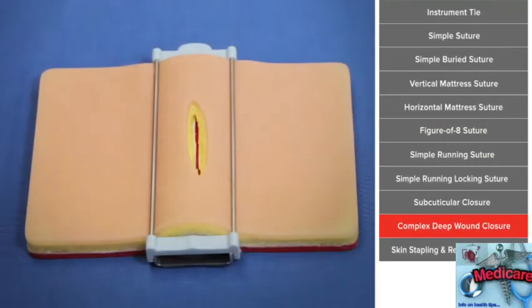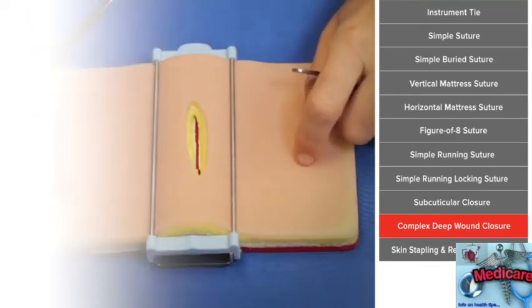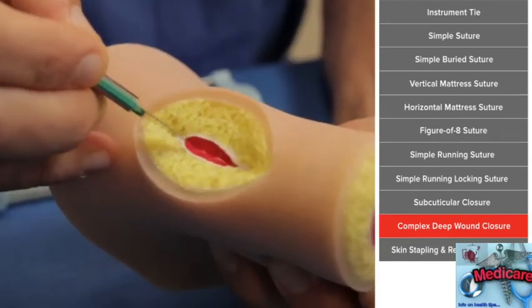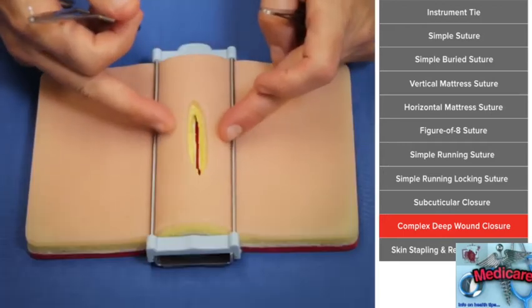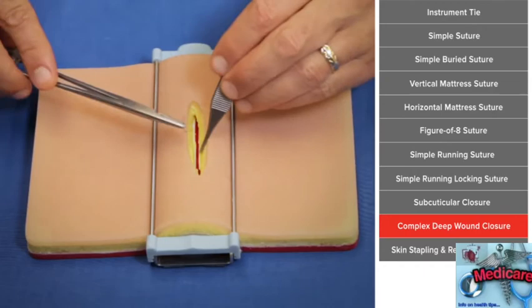One of the advantages of the Vada pad is that all the layers of closure are represented. So we not only have the skin and dermis, we also have some fat, which feels very lifelike. And then deeper we see the white, what I will call fascia, or the lining of the muscle, and below is some red, which represents muscle. Generally the strength of closure, especially in deeper wounds, is going to be that deeper white fascia.